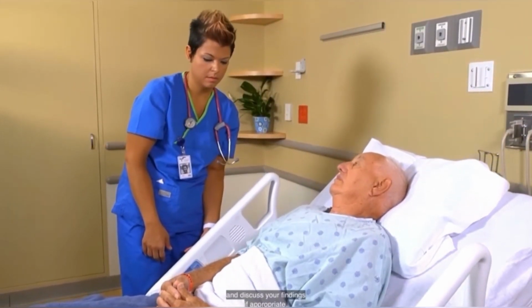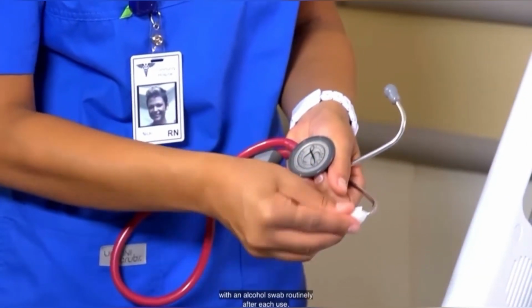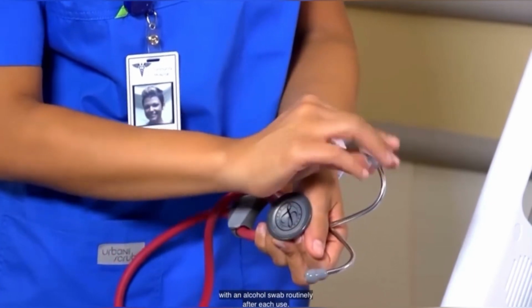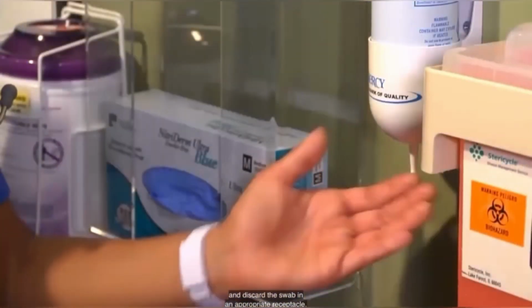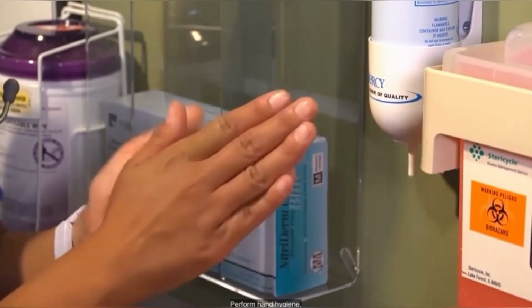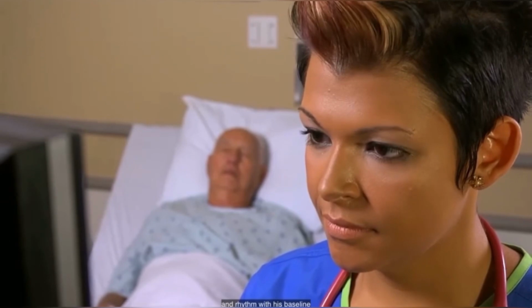Then replace the patient's gown and bed linen, help him into a comfortable position, and discuss your findings if appropriate. Clean the earpieces and diaphragm of the stethoscope with an alcohol swab routinely after each use, and discard the swab in an appropriate receptacle. Perform hand hygiene. As part of your follow-up, compare the patient's pulse rate and rhythm with his baseline.